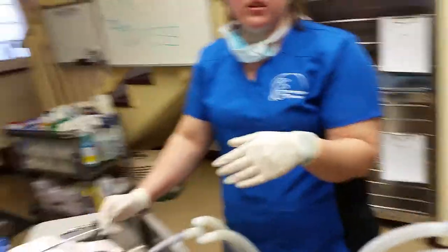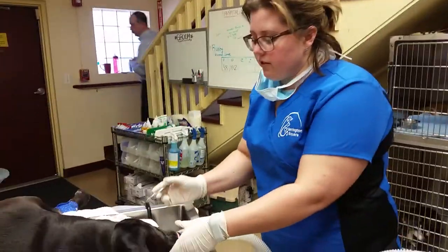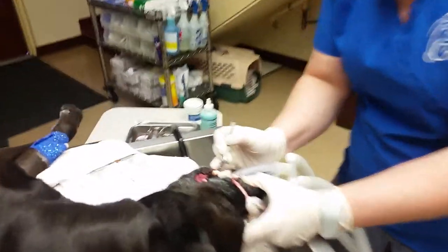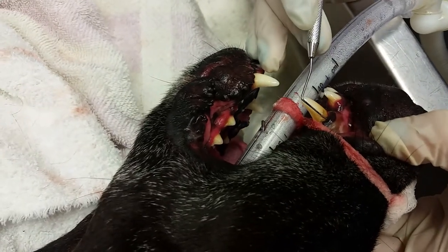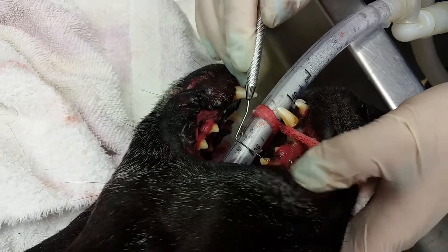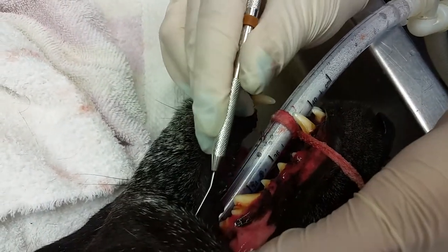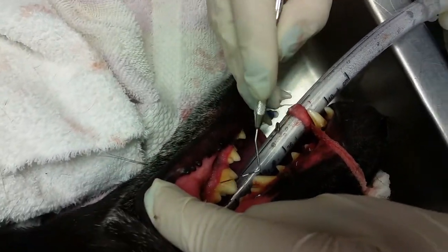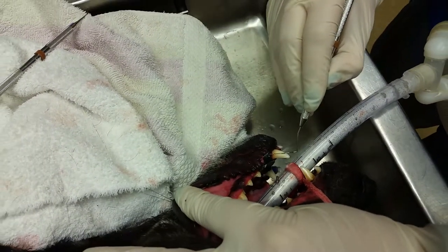We already scaled and polished the one side that we did X-rays on, and now we've flipped it and we're going to do the left side. First thing I always want to do is measure for pockets. He's not too bad over here. We will definitely make the doctor aware of those canines having a small pocket underneath of them, and then I'm going to probe just the outsides real quick and go from there.